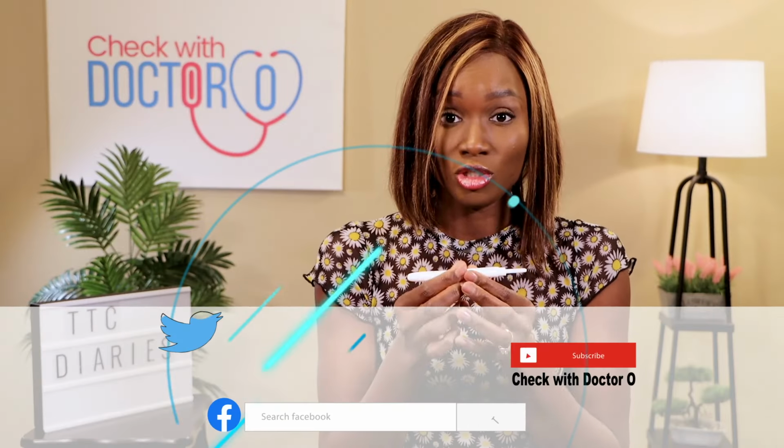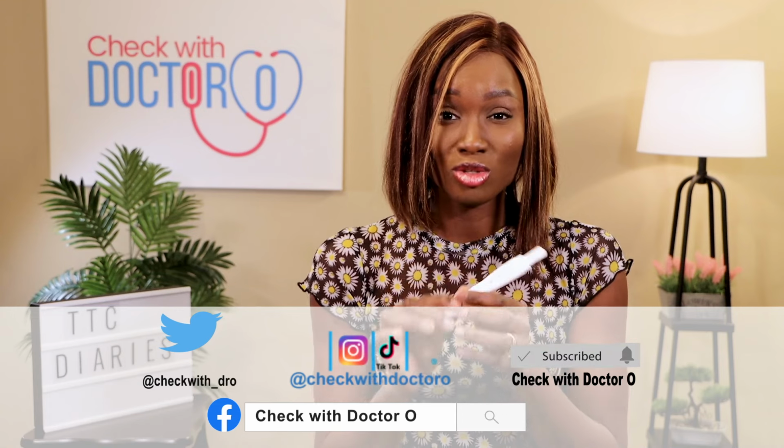So some might tell you, oh, dip it into the urine. Some will say, no, use a pipette to put it in the circular area. Some will say use 2 drops, some will say use 3, so you really have to read the instructions. Some will say, after you dip it inside urine, you need to wait for this amount of time, right? So you can't use the amount of time you're supposed to wait for another pregnancy test kit for the one you're using right now. You have to be sure that you read the instructions to make sure that you're using the pregnancy test kit the way the manufacturer recommended it. Very important.